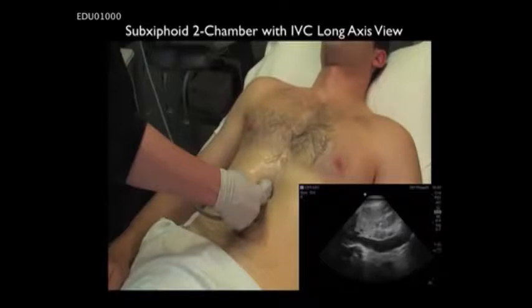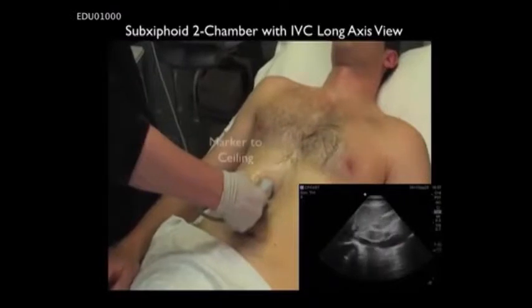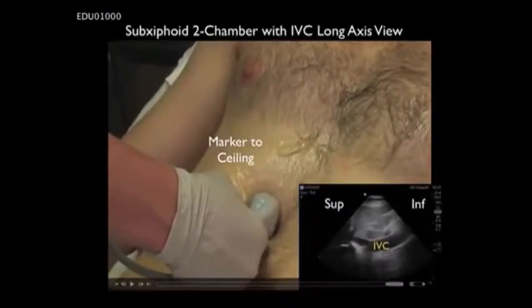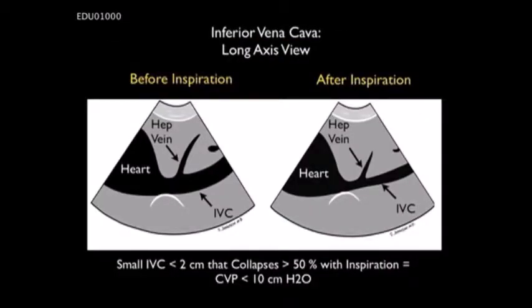The next step is to visualize the IVC in the long axis configuration to corroborate the findings found on short axis view. To do this, the probe is swiveled with the IVC in sight from the short axis view with the marker dot oriented towards the patient's right to the long axis plane with the probe in an up and down configuration and the marker oriented upwards towards the ceiling. In this way, the IVC will appear as a tubular structure running up and down the screen with the superior aspect towards the left and the inferior aspect towards the right of the screen. In this illustration, we see a long axis configuration of the IVC.